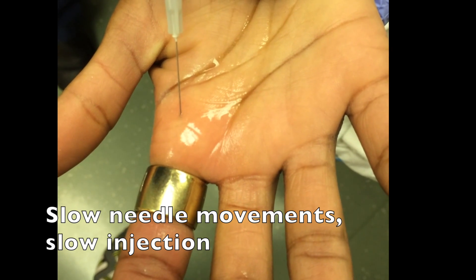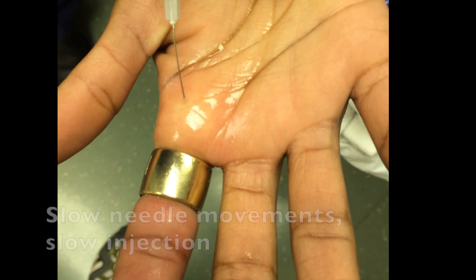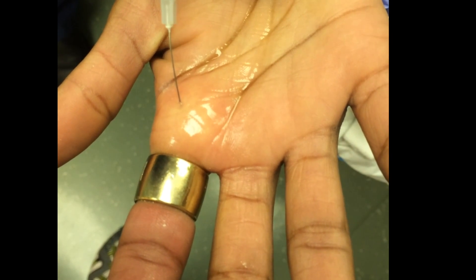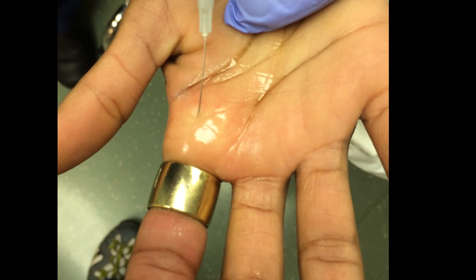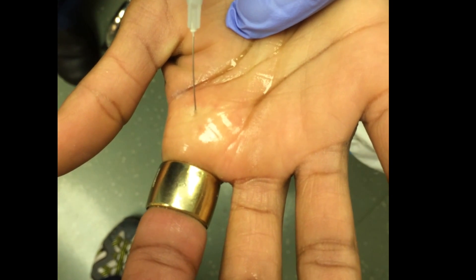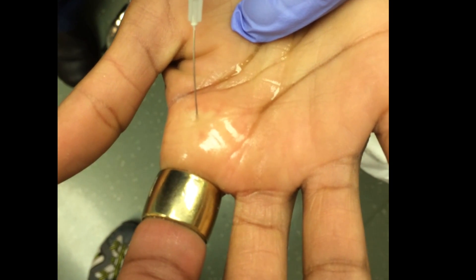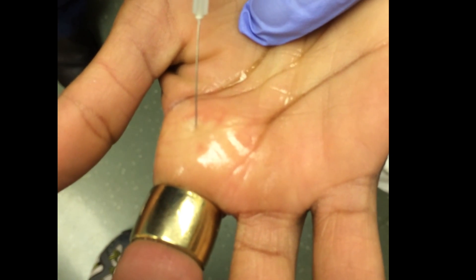Use slow manipulation of the needle and very slow injection, and make sure when you inject that anesthetic, you're finding a place that's relatively resistance free. You should only need to use about 2 or 3cc's of local anesthetic. The anesthetic is dealer's choice, but typically lidocaine or bupivacaine without epinephrine are excellent choices for this technique.